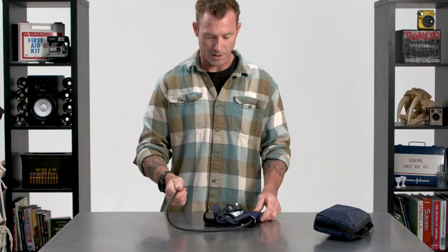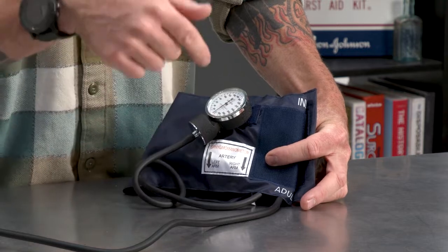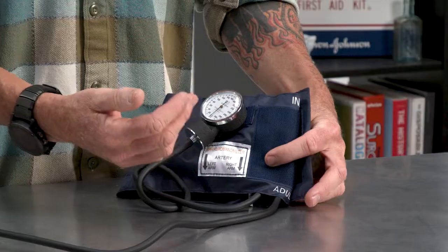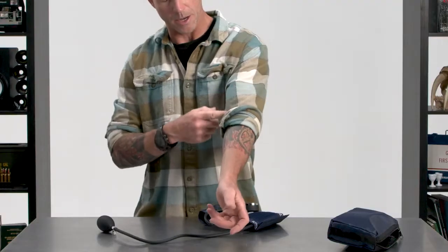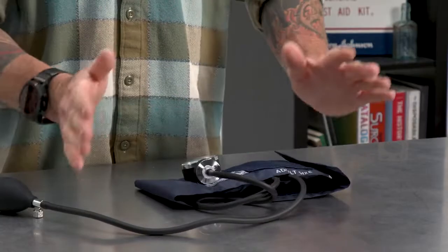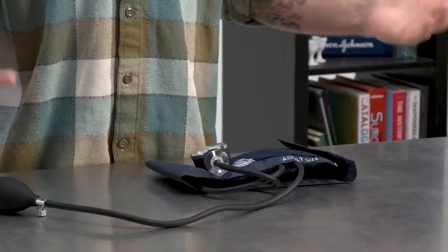Some cool features on the cuff — it's pretty dummy-proof in that it labels right arm and left arm. It's got arrows right where to line up the artery in this area here. Everything's very clearly labeled, very simple and easy to use. So that's the cuff itself.